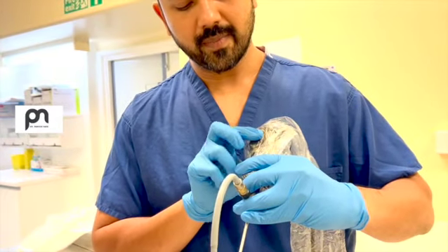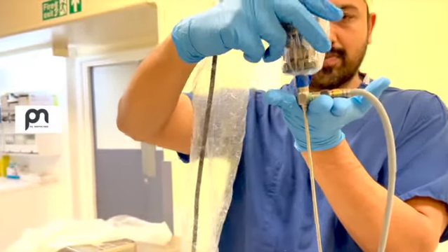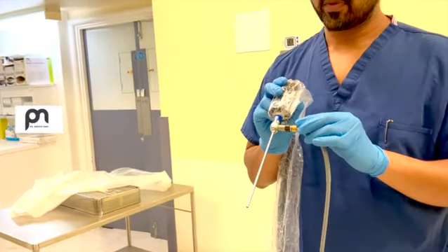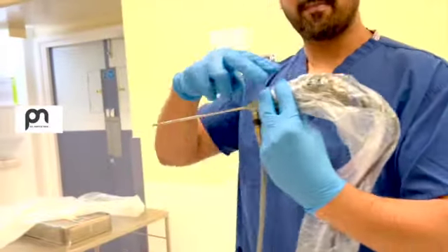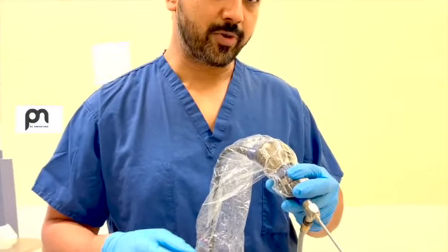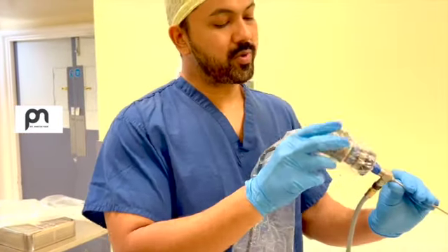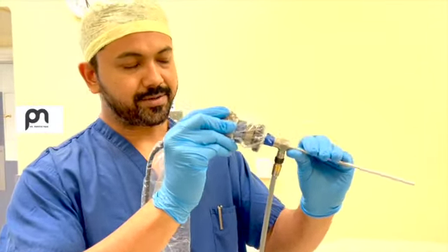The second way of holding is, some people like to hold it this way. So I'm putting the endoscope on this and supporting the weight with a thumb. So the patient is lying down, you go like this. Okay? Now, the third way of holding, as you can see, is also just 2 fingers above and the remaining 3 fingers underneath. The benefit of that is you're getting the weight distributed. Some people do hold the endoscope this way. I mean, personally speaking, I find it difficult because when you're holding it this way, the weight of the camera comes down. You can see how my thumb is getting all the weight.